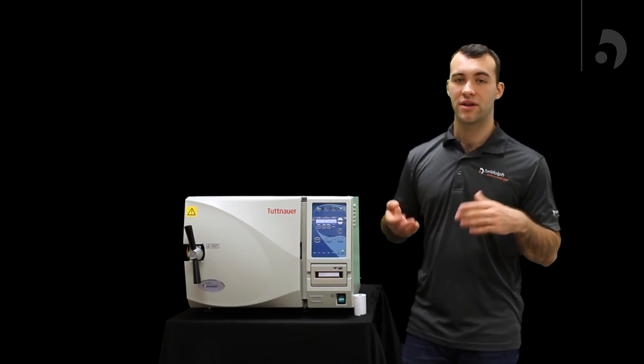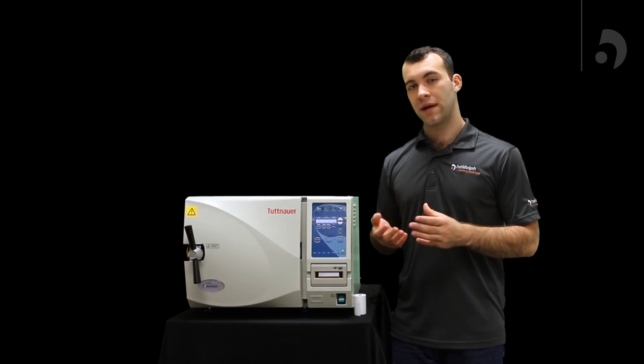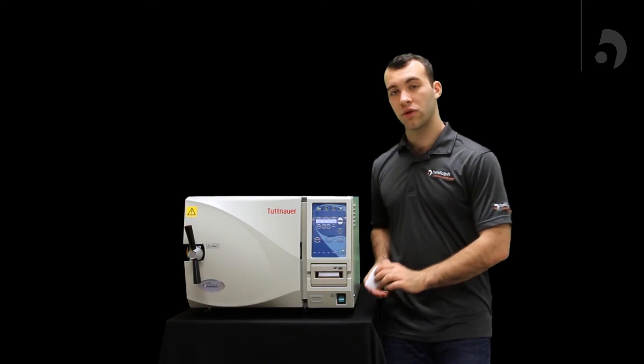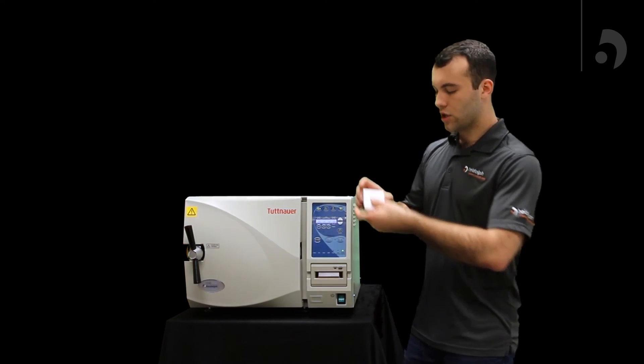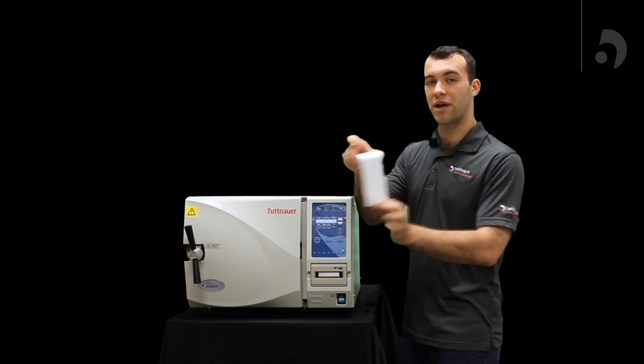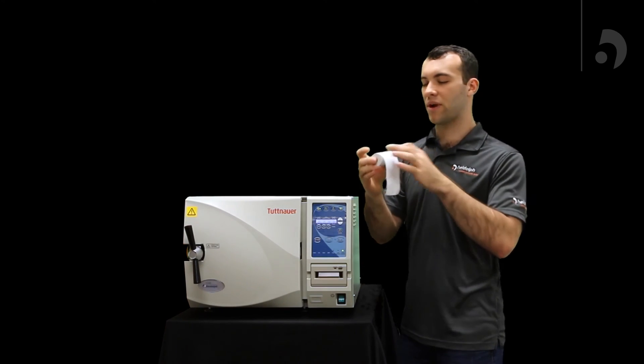Another common inquiry we get is regarding the printer. Sometimes it's spitting out printer paper, but not actually printing. This is due to the nature of thermal paper only printing on one side. The side you're going to be printing on is the top. So you want to make sure you insert your printer paper over the top like so. That should fix your problem right there.